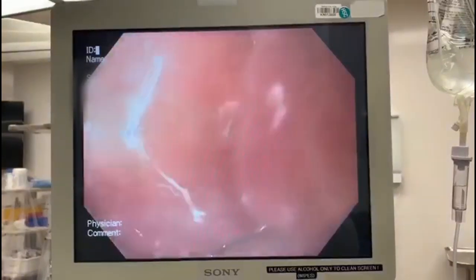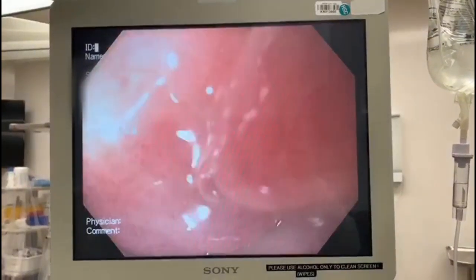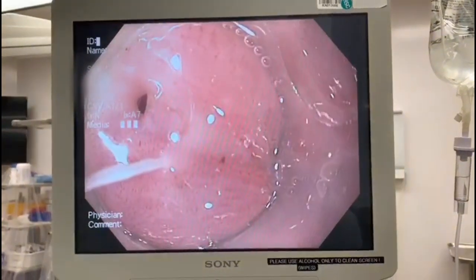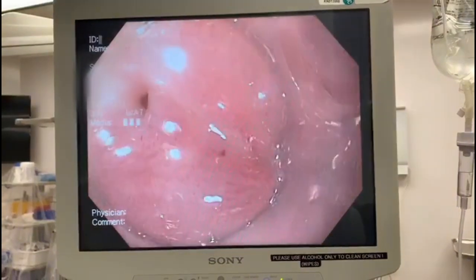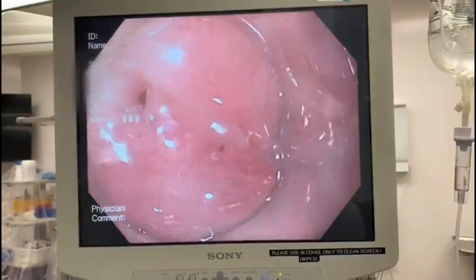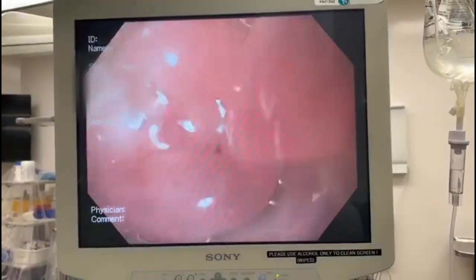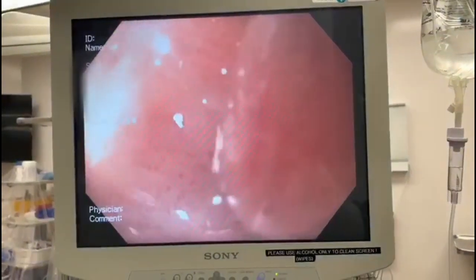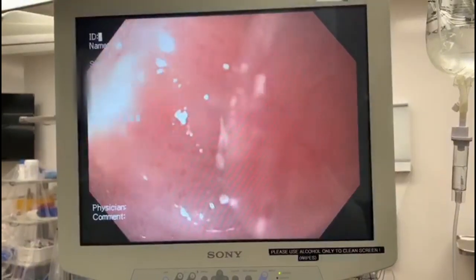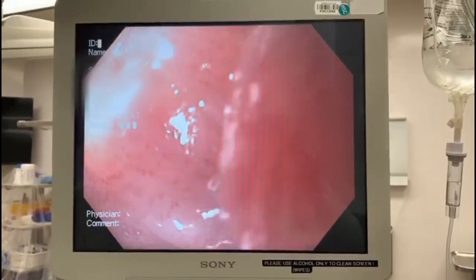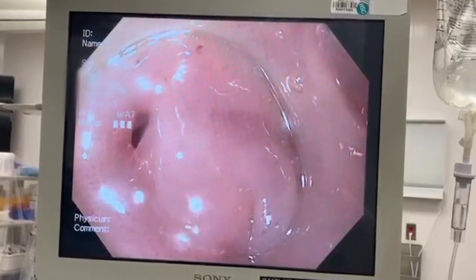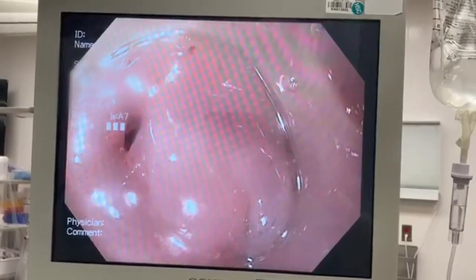With the mouth of the diverticulum held open, we decompressed the mediastinal abscess, draining a large amount of purulent debris. The patient's tachyarrhythmia resolved intraoperatively following drainage of the mediastinal abscess. The abscess was irrigated and suctioned until clear.